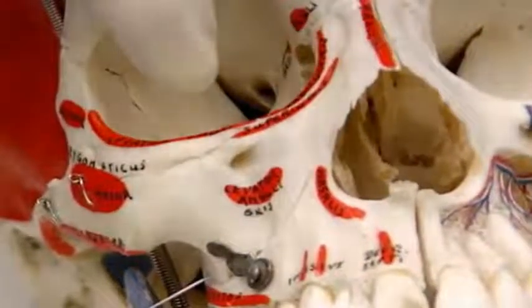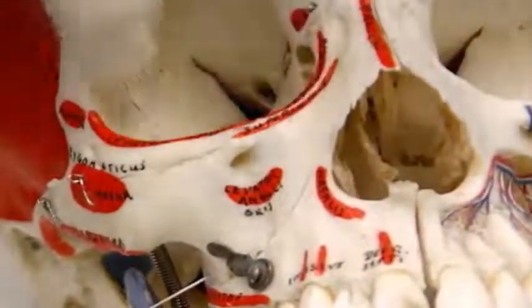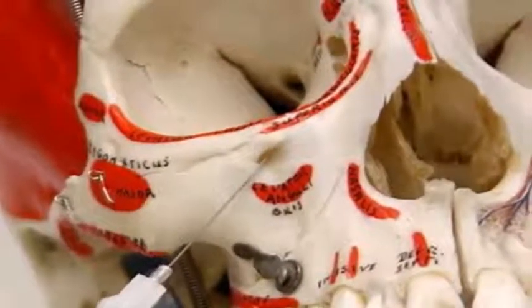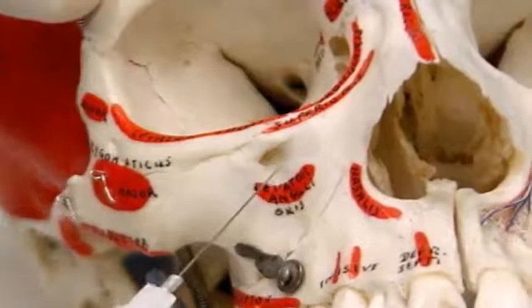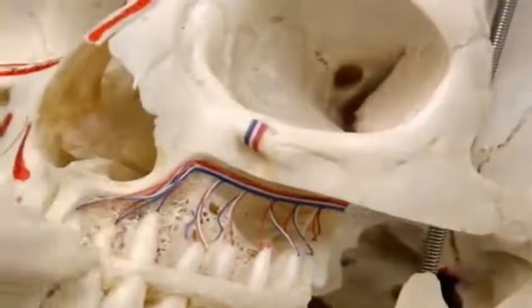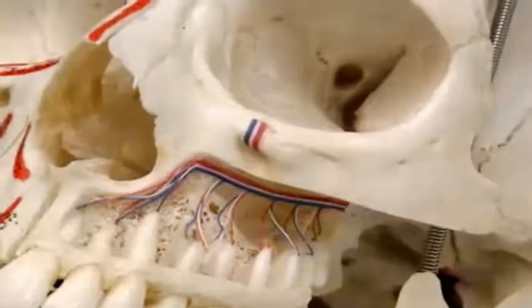The target is the infraorbital foramen, which is directly below the rim. The solution will be deposited at the foramen and not into the infraorbital canal. This anesthetizes the anterior superior and middle superior nerves.